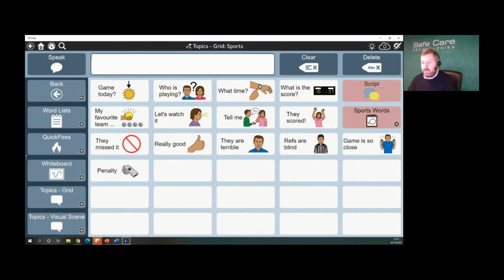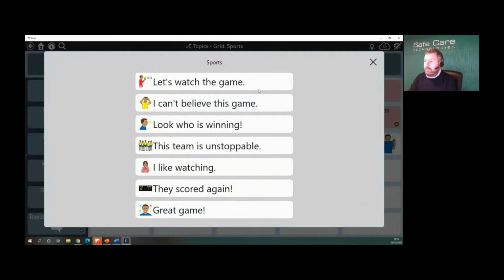You also have scripts. So again, these are really good and powerful to use. So let's watch the game. I can't believe this game. Look who is winning. So we might have a pre-made conversation prior to an event or a meeting or something that we're doing.